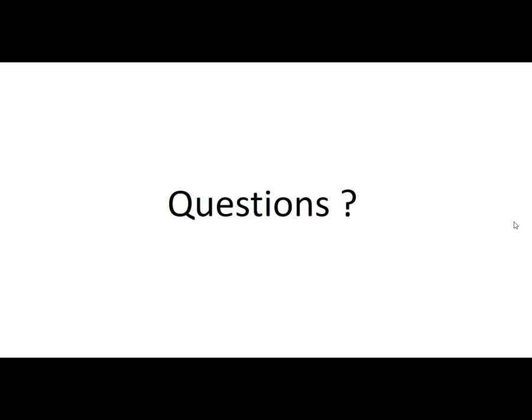So along those lines, another question just came in. Should an elevated ALT be considered in some sort of an algorithm or calculation to maybe correct for or better interpret the KPA? I think you just mentioned a little bit about that, but I don't think we really have an absolute number. If the patient's AST and ALT are less than 150 or 200, it probably doesn't make any difference. If they're higher than that, it may make a difference. We don't know for sure.